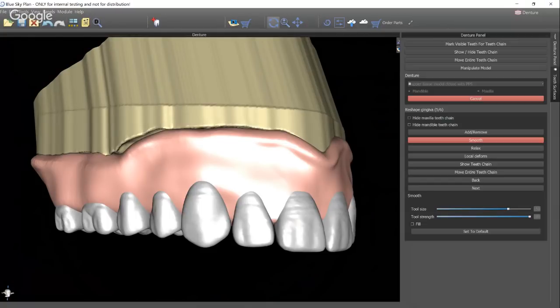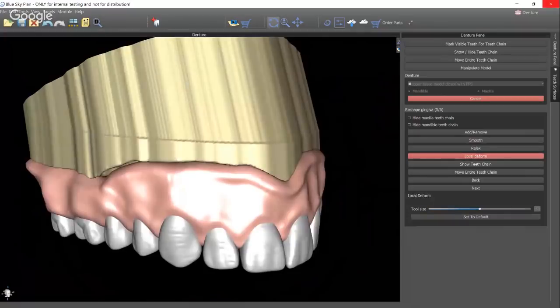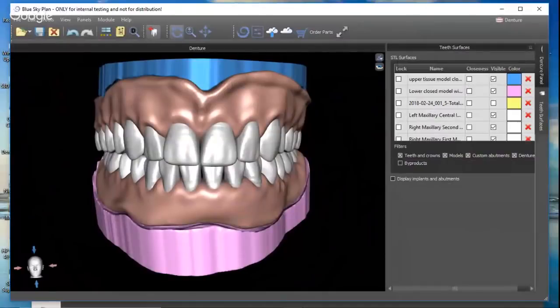I've covered up the necks of those teeth. I've gone and added a little bit around the gingiva to kind of make a gingival roll. And again, this is where you can spend the most time. So do you see now developing root prominences? I'm using this local deform tool. I'm developing the gingival roll, which is that raised area that follows right around the gingival margin of the tooth. And so knock yourself out, get as fancy as you want.